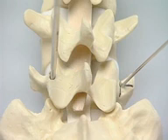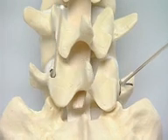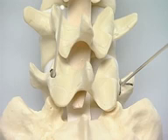After drilling the pedicle on the left and inserting the K-wire, the difference in angulation of the K-wires using the two entry point methods can be seen. Use of the medial entry point is not appropriate beneath a non-instrumented normal facet joint in the surgical situation.